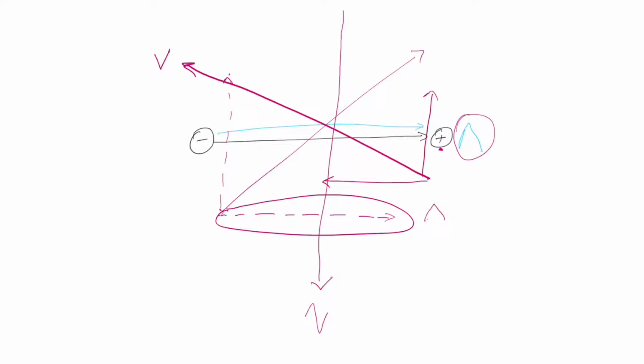So based on the intensity of the wave, as well as whether it's positive or negative, you can pretty much figure out which way electricity is flowing. Now that we have a good basic understanding of how leads work, let's think about how we can structure a system to best understand the direction of flow of electricity. For you to define the exact direction of current flow, you would have to measure the current flow in at least three different dimensions, right?